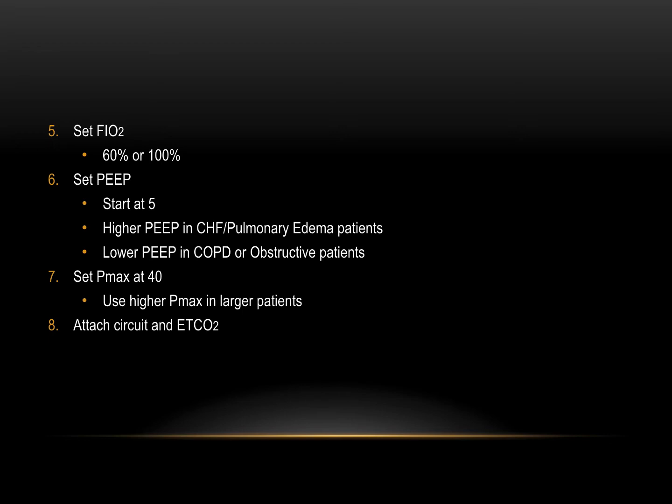But if you set it at 20, it's going to reach that pressure limit too soon, and they're probably going to tell you, if they're a long-term ventilator patient, that they're not getting enough air. But if they're RSI'd, you might be delivering lower volumes to the patient than you actually want to, and you're going to have that pop off.